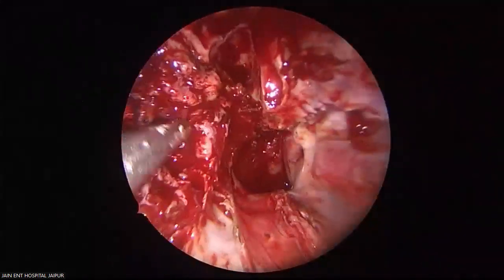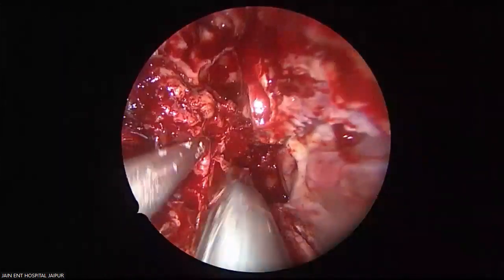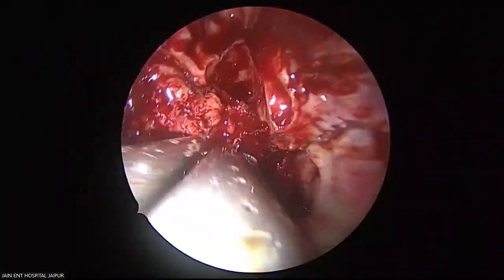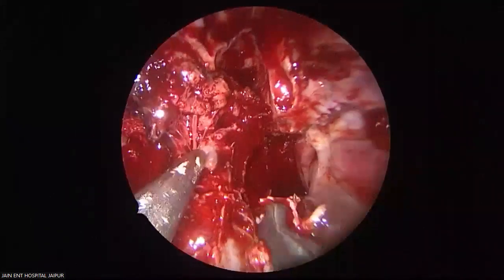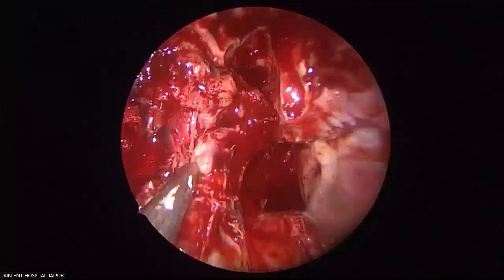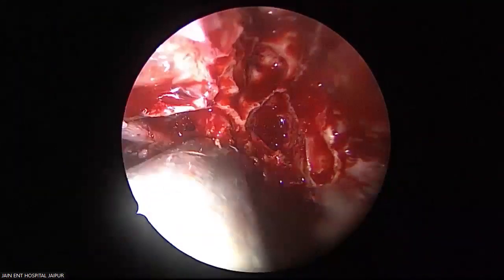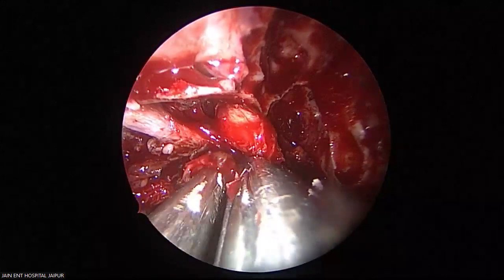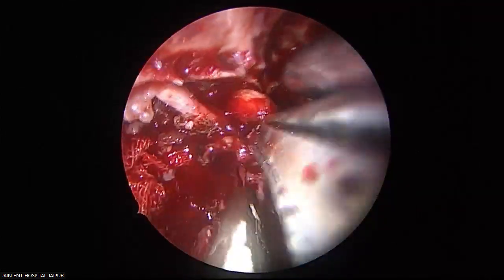From our scan. Tumor is occupying the pterygoid fossa. The bone on the surface was looking normal. And see, now what I will do, one by one. Can you see the V2? Excellent.